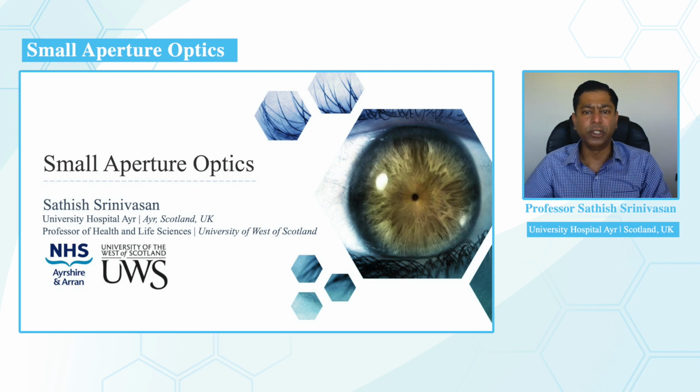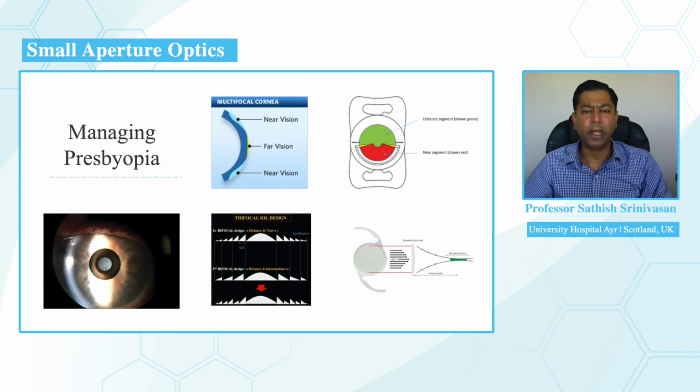Today, I'll be talking to you about small aperture optics. As you know, the management of presbyopia is the Achilles heel for any refractive surgeon. And there are several options available in the management of presbyopia.